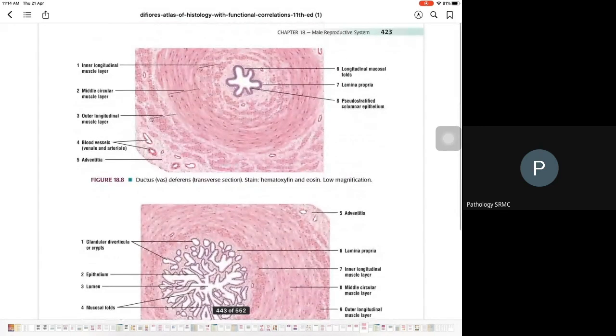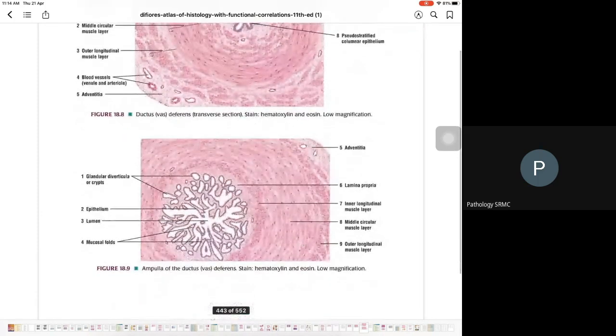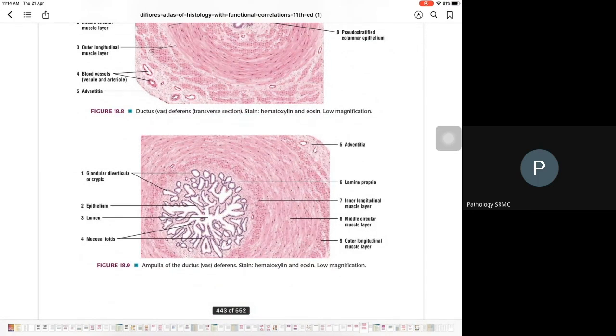You have to remember that the vas deferens, ureter, and the epithelium of the genitourinary system can show atypical cells. When you see atypical cells, what is the other thing you will be looking for? Mitosis. If no mitosis, only atypia, what do you think? Reactive atypia, sir. Any other name? Degenerative atypia.